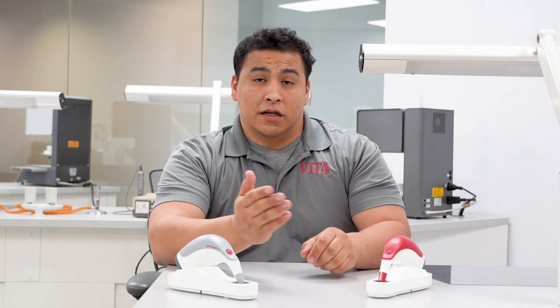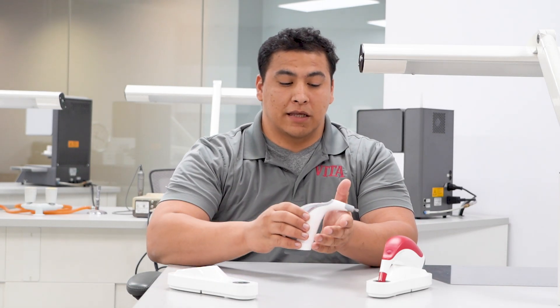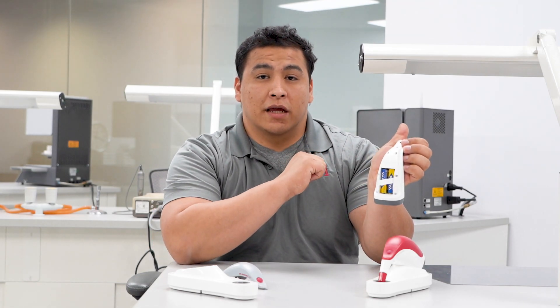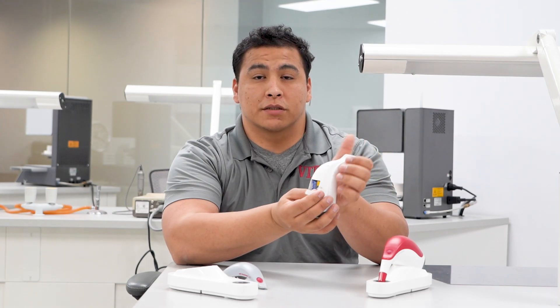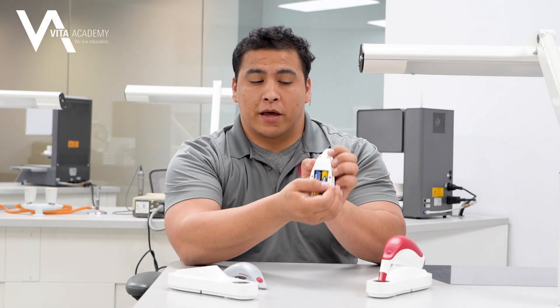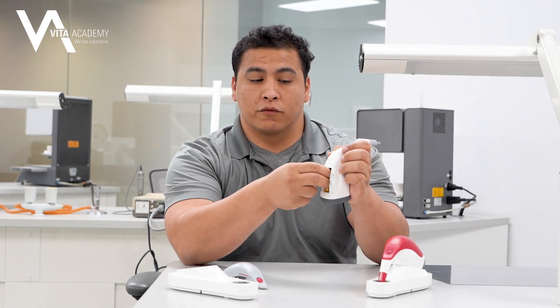The Vita EasyShade Lite is very similar in how battery access works — it's the same process. However, the Vita EasyShade Lite batteries are not rechargeable; they use standard AA batteries. It also comes with a little pull tab to help you remove those batteries. Just go ahead and give that a pull and it'll help you in the removal process.